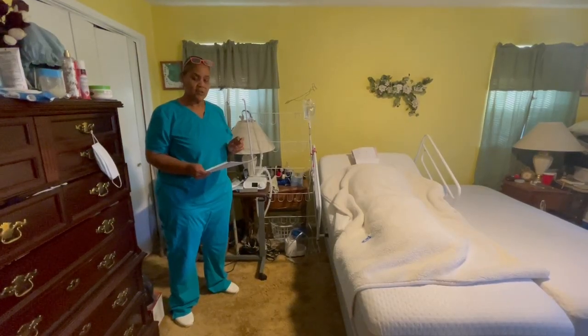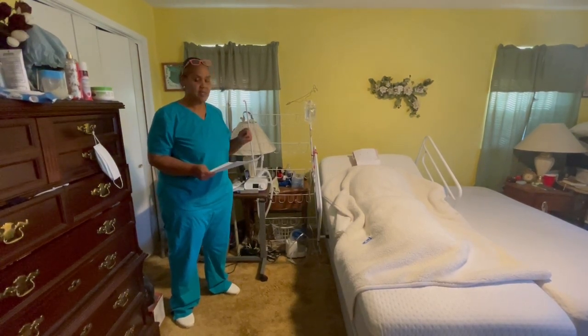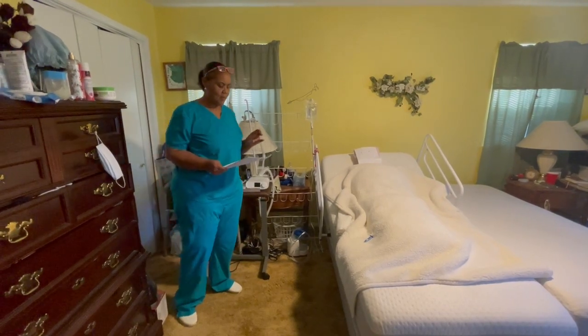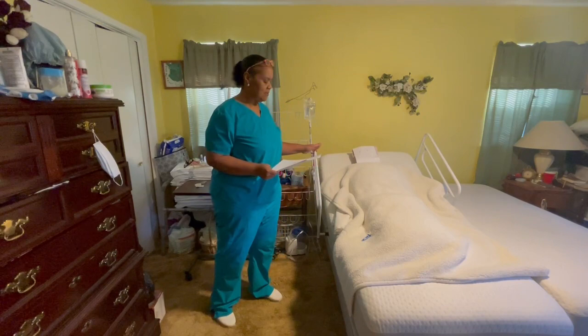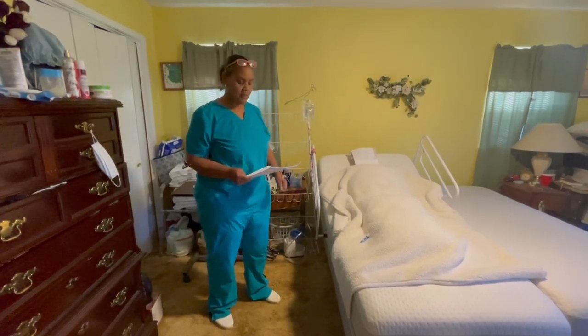My name is Vicki Turner, and I'm going to give scenario number one for administration of an antibiotic through a secondary tubing. My patient is Mr. Shepard. He is a 72-year-old male. He was admitted with exacerbation of COPD. He does have a chronic tracheostomy, and he maintains at home with assistance from his family.